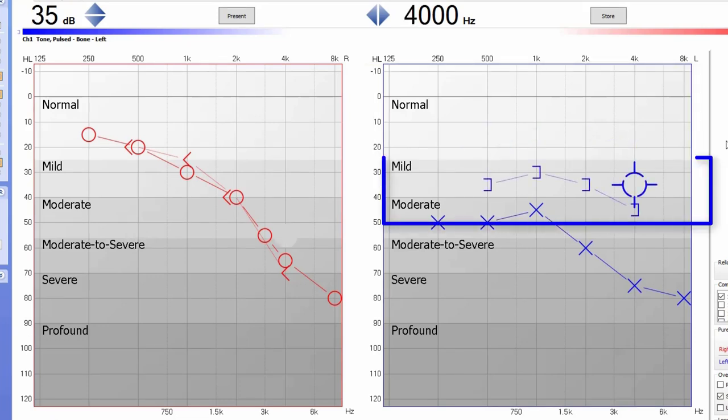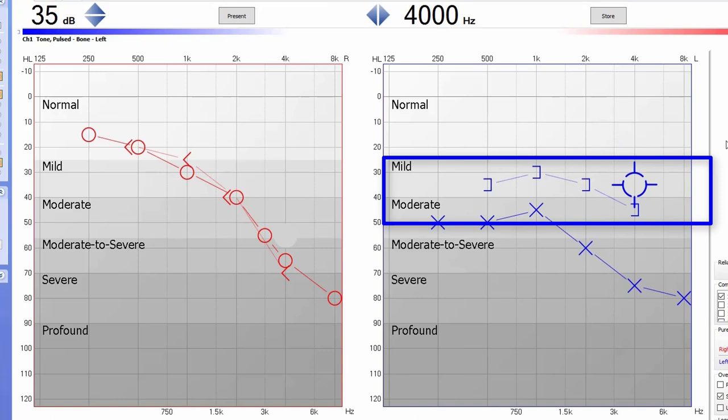If these brackets are in the mild range or worse, but there is still a significant gap between them and the X's or O's, then you have a mixed hearing loss. This is the combination between a sensorineural hearing loss and a conductive hearing loss at the same time.